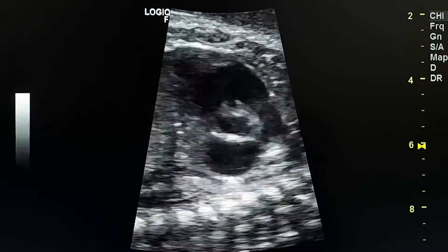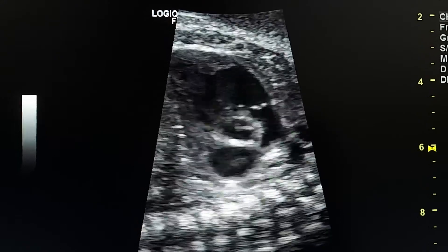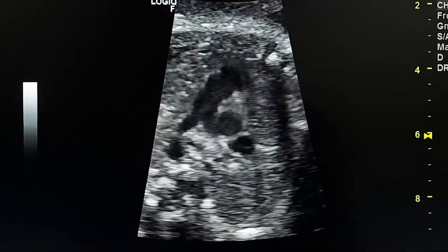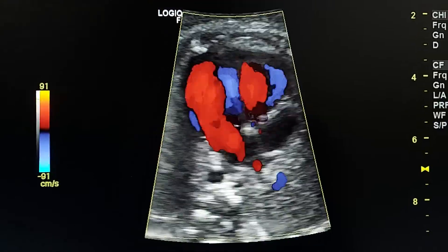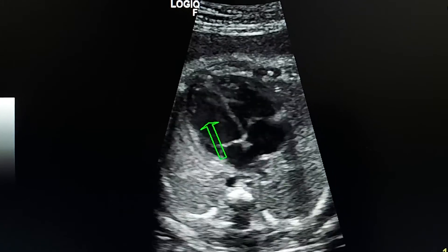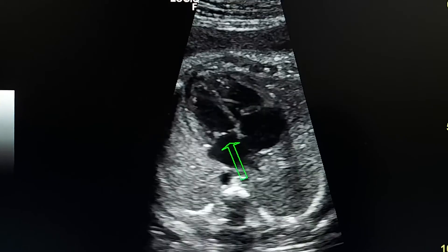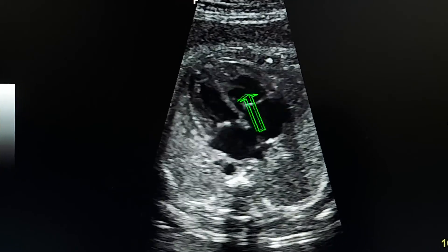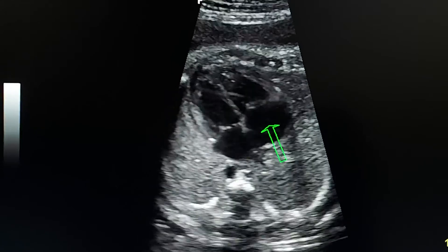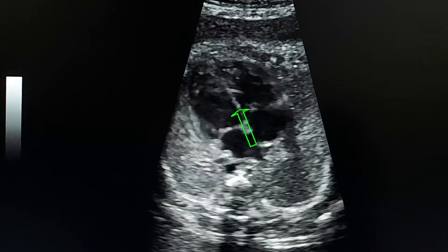Right ventricle outlet. This is the 4-chamber view showing the left ventricle, left atrium, right ventricle, and right atrium. This is the interventricular septum.